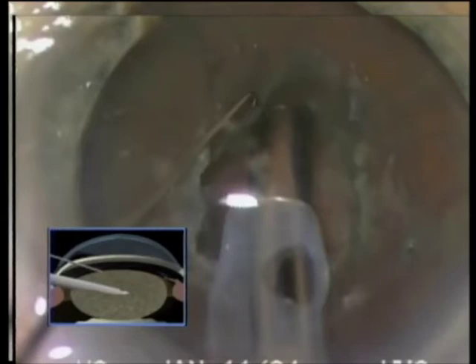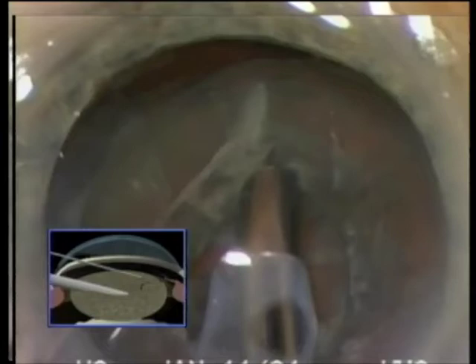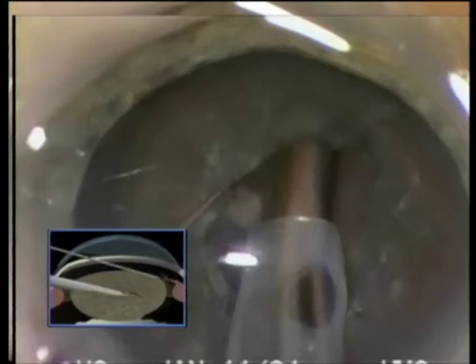Now shown at one and a half times normal speed, the phaco tip is buried into the nuclear rim with a burst of ultrasound and the Sinsky hook is brought under the capsule and the rim is sliced for a chop. The lens is rotated; again the tip burrows into the rim. The hook is carefully placed under the capsular edge, out to the equator, and pulled against the tip to create another fracture. This time, rather than leaving it in place, it's emulsified as it is already on the tip of the instrument. The lens is rotated, additional fractures and segments are produced and emulsified as they are broken away.